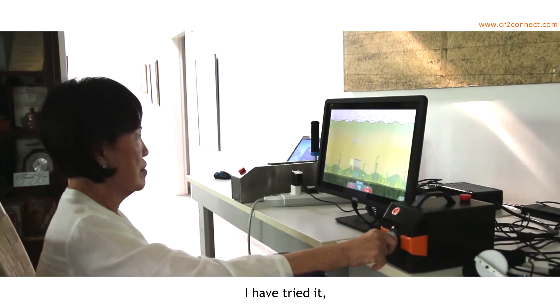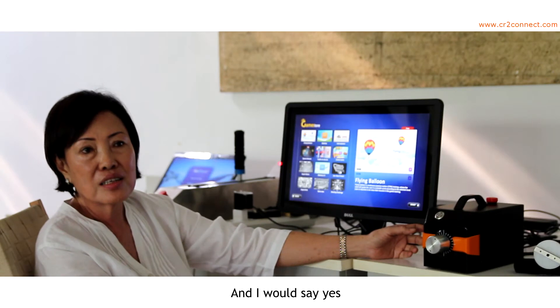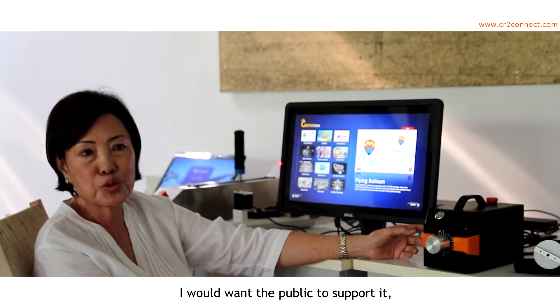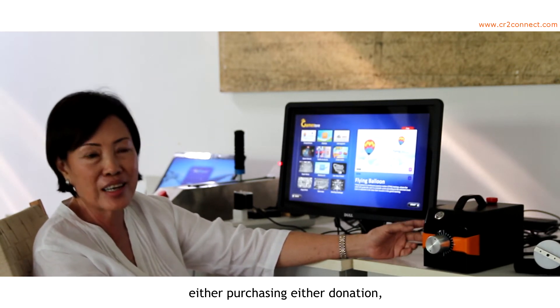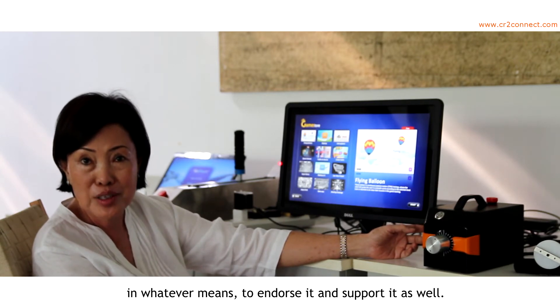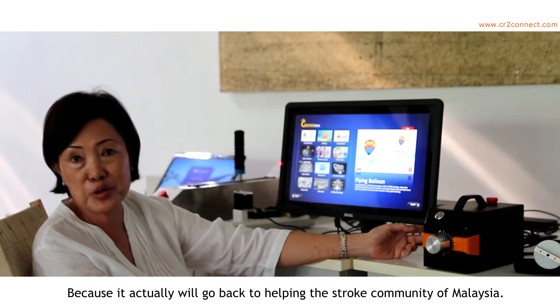We have tried it. I have tried it and my therapist has tried it. I would say yes, I would want the public to support it in whatever means — either purchasing, either donation — whatever means to endorse and support it. Because it will go back to helping the stroke community of Malaysia.